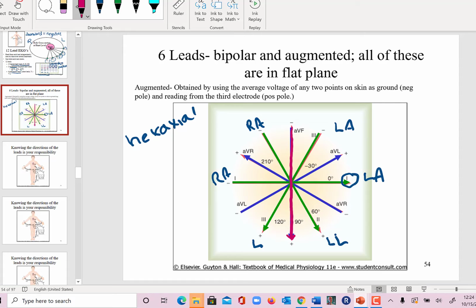poles. So for example, put your arms straight out, abduct them so that you look like you're being crucified on a cross. Let's just pretend we're doing that. Your arms are straight out. And pretend that each of your electrodes on your wrists are negatively charged. Where is the average space between your 2 wrists? Did you say your head? Isn't that the middle part? Isn't that the central region between your two wrists?